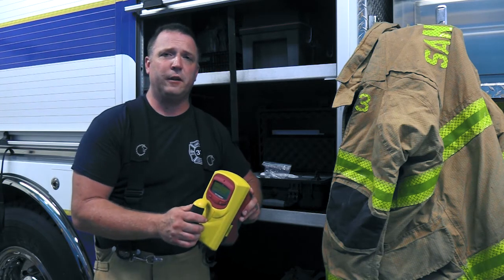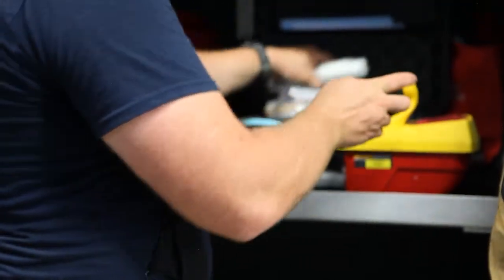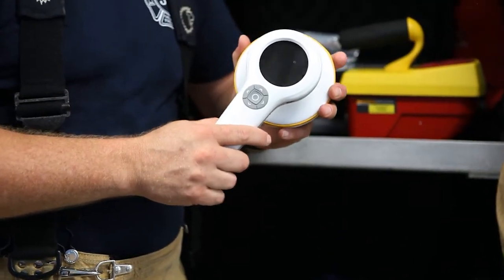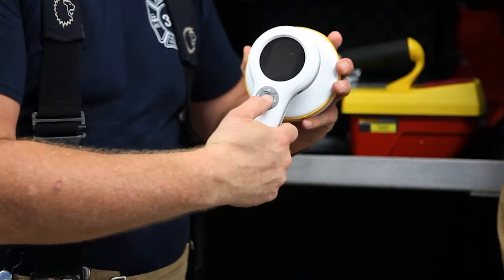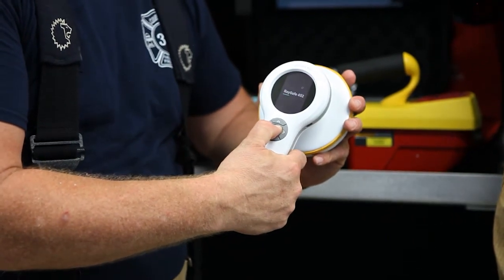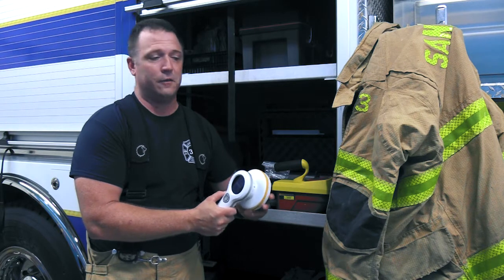So let me show you a new device by Fluke Biomedical and our RaySafe team. This is the Fluke Biomedical 452 survey meter, a brand new device from our teams. The 452 powers on simply by pushing the center button, and as soon as it powers on, it's ready to start taking readings, as you can hear it clicking.